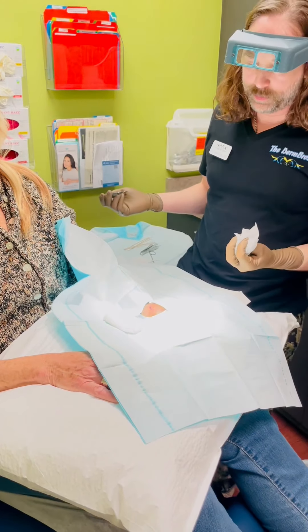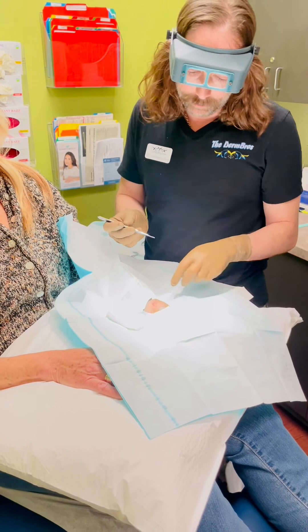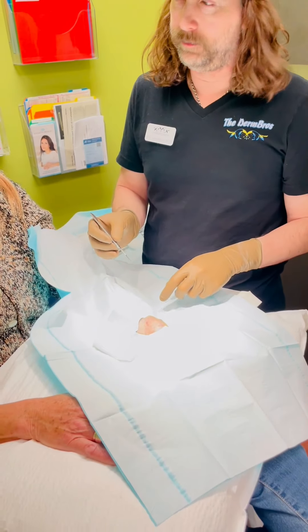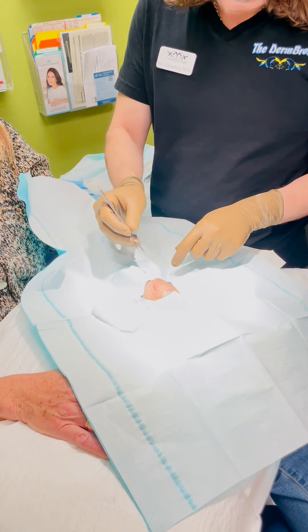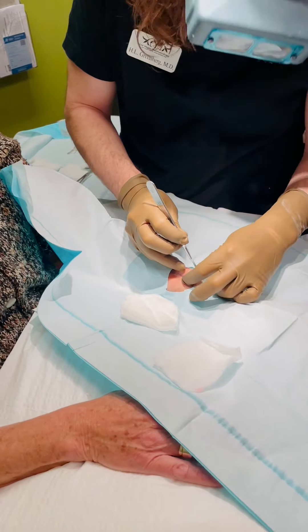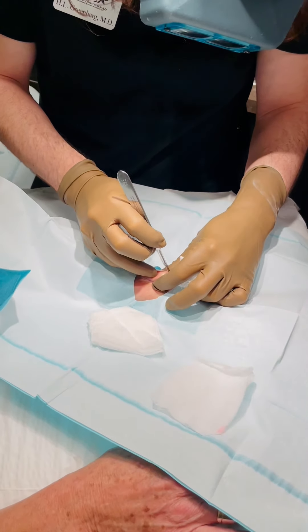The area's already been anesthetized and marked. I also marked a vein right here because I don't want to hit the vein. What I'm going to try and do is nick over the top and pull it out for a smaller hole, which would make it easier. You can see where I'm at.